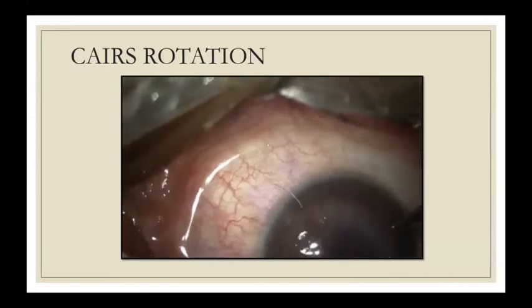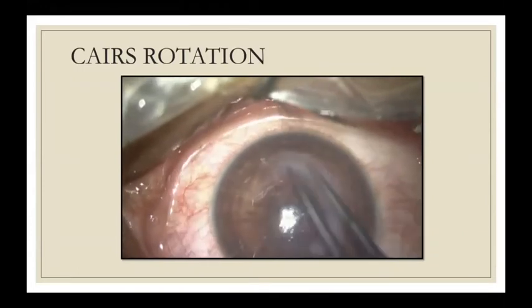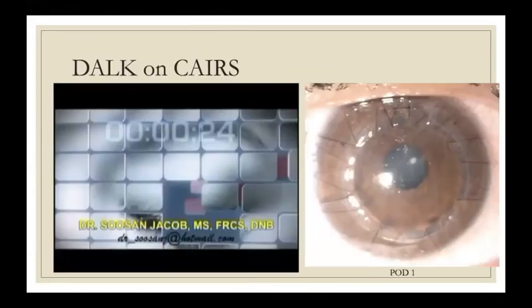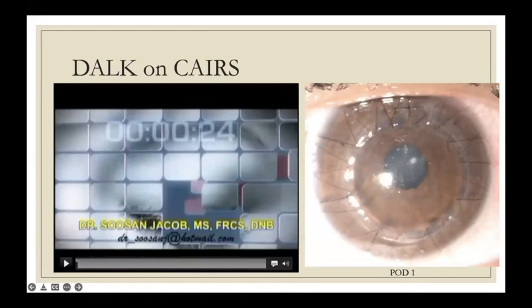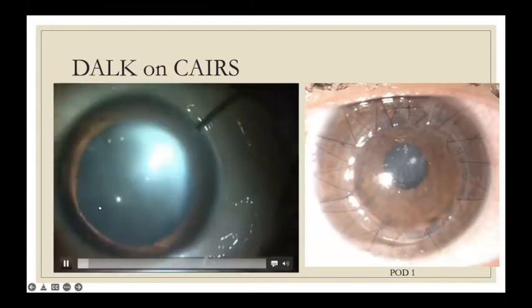You do have a little bit of fibrosis at the edges, a little bit of stronger adhesion at the edges, but ultimately you are able to, with some amount of effort, make it move in its channel within the cornea. Of course, it would not move on its own, for example, by patient rubbing, but you would actually have to use physical force to move it forwards.